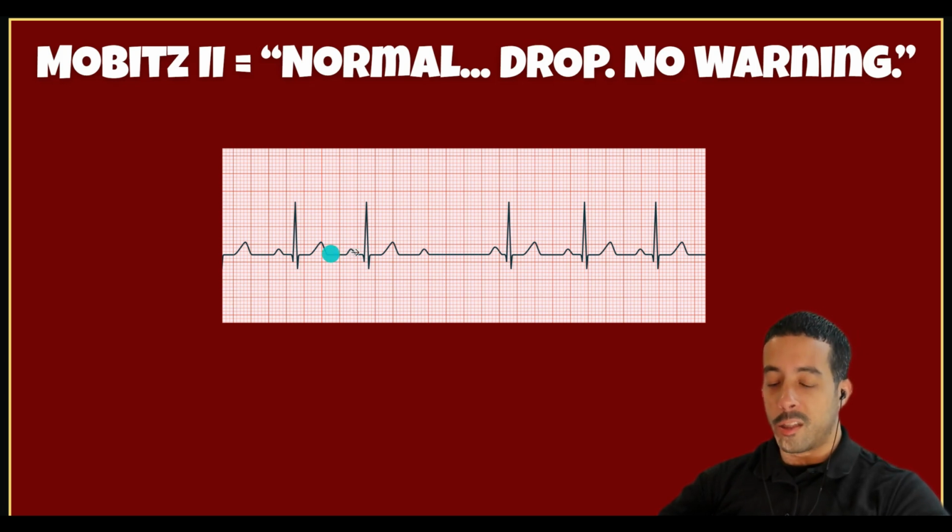So when you see these patients, be sure to recognize it, take their vital signs, do a 12 lead if you have time, and skip the atropine, because here the atropine will not be effective. Most likely these patients are very symptomatic and you've got to go straight into transcutaneous pacing. Start a dopamine IV drip after starting the line, and transport this patient to the hospital immediately and give a notification.